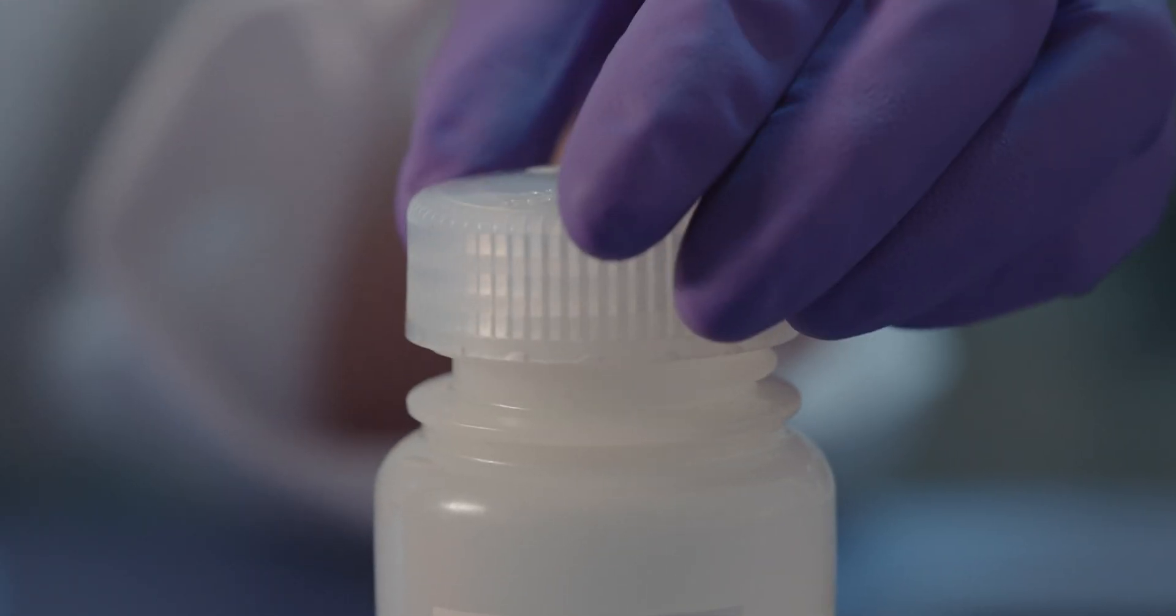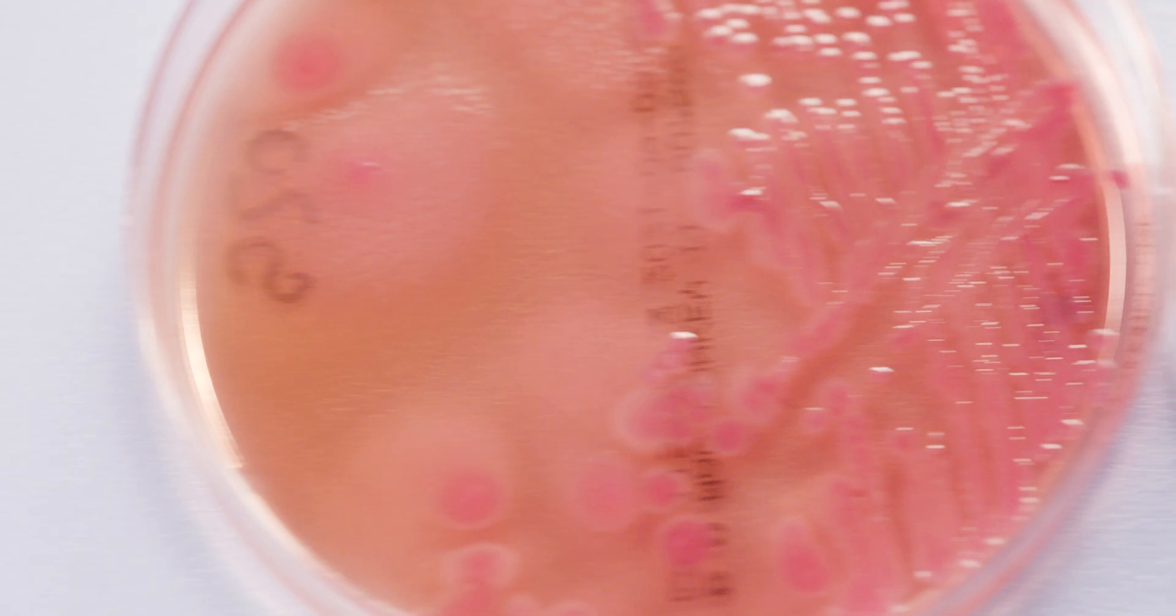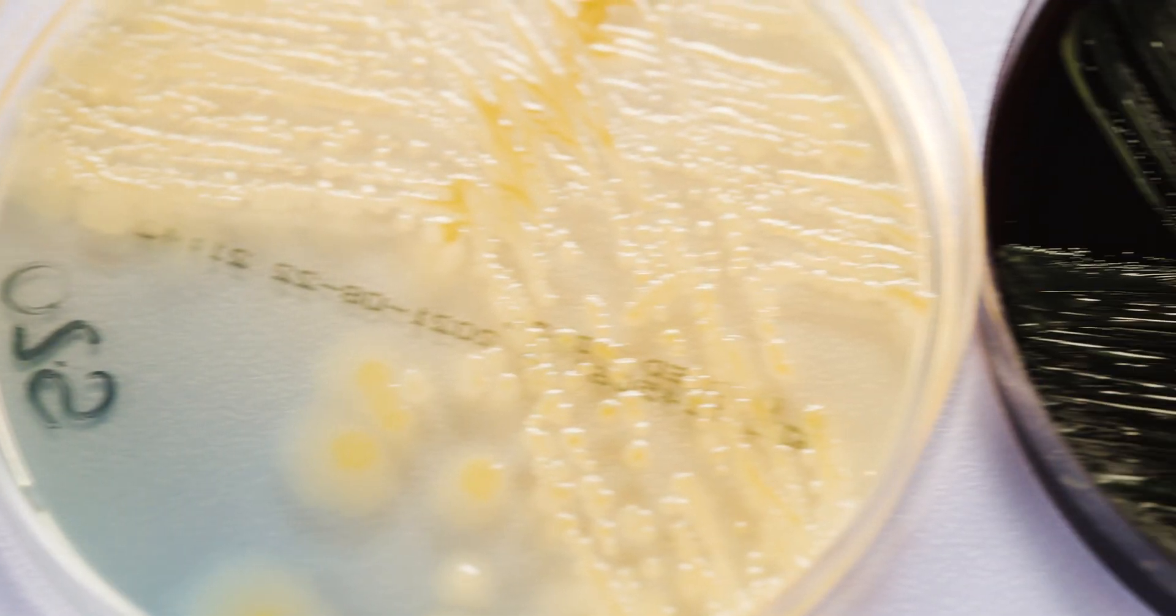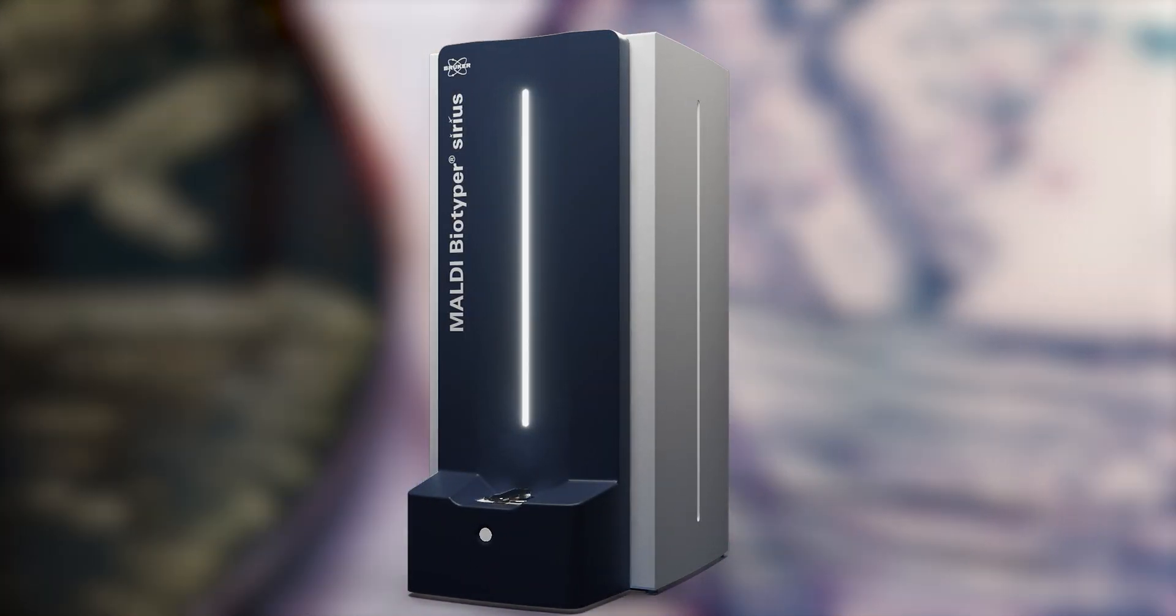Today, the identification of microorganisms in modern microbiology labs is unthinkable without it.